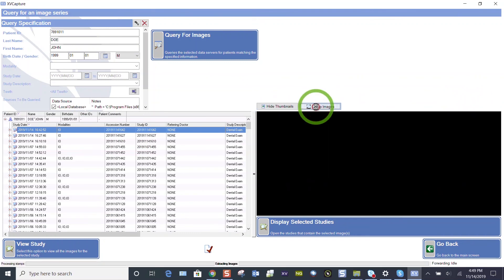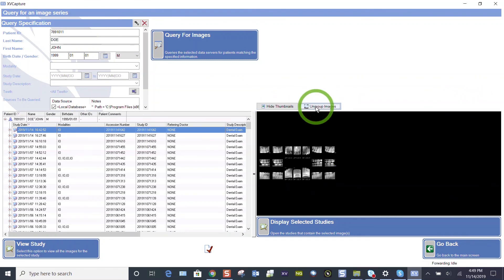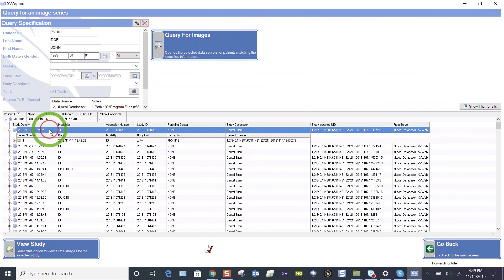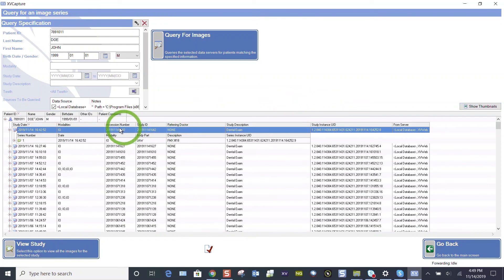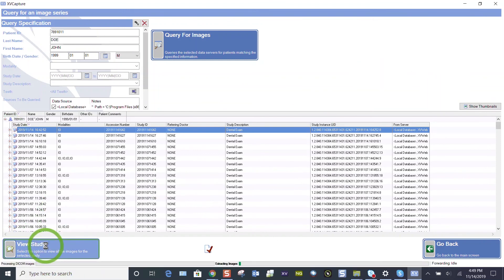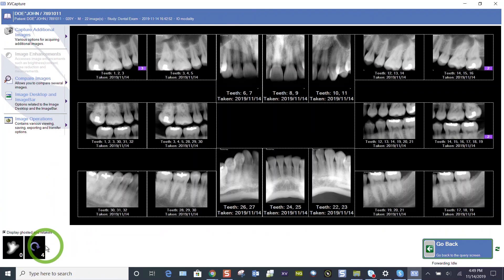Just group those images. So here's my FMX 18. I don't need those thumbnails. I know the date. I know the time. I can double click and it's going to tell me that that is an FMX 18. I can expand and collapse that. So whether you show the thumbnails or not, click on view study, and that's going to bring those images back up to where we were.